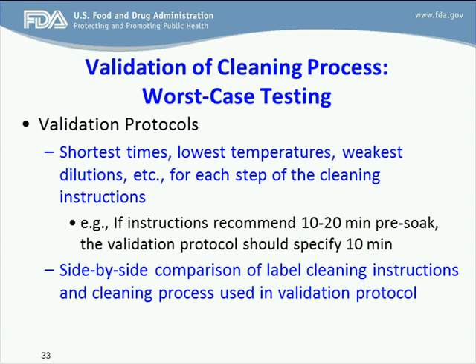The validation protocols should use, for example, the shortest times, lowest temperatures, and weakest solutions for each step of the cleaning instructions. For example, if the instructions recommend a 10 to 20-minute pre-soak, the validation protocol would specify 10 minutes as the soak time. A side-by-side comparison of the labeled cleaning instructions and the cleaning process used in the validation protocol should be prepared and provided.